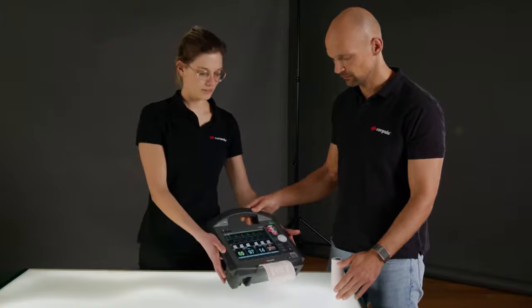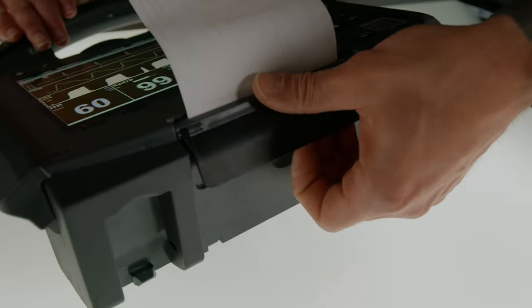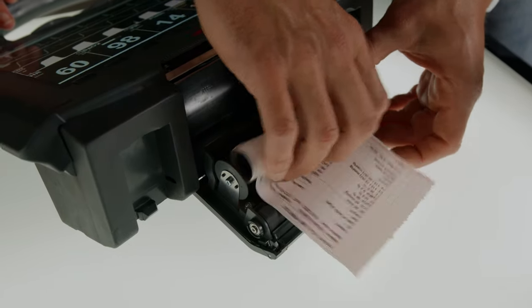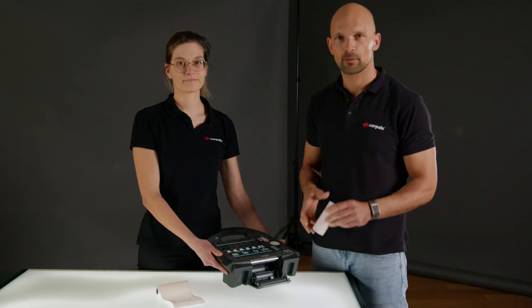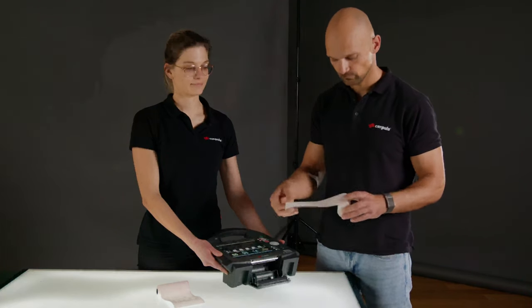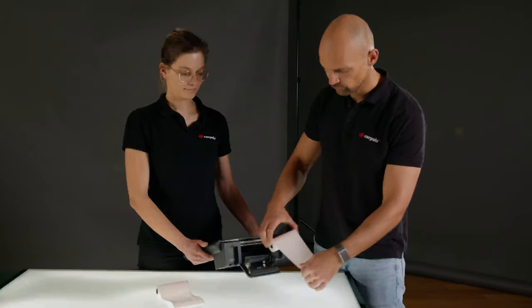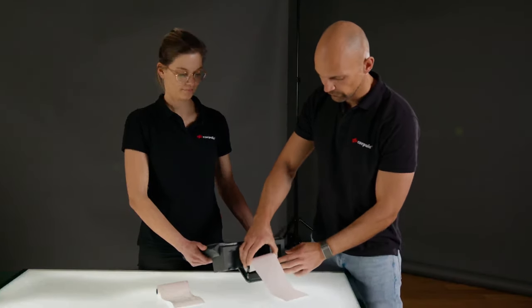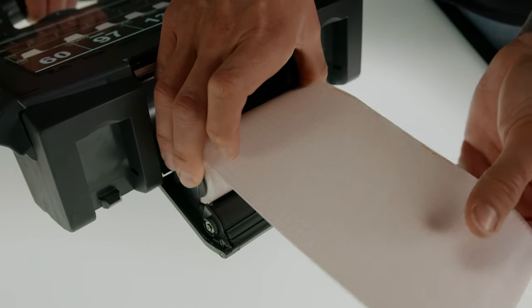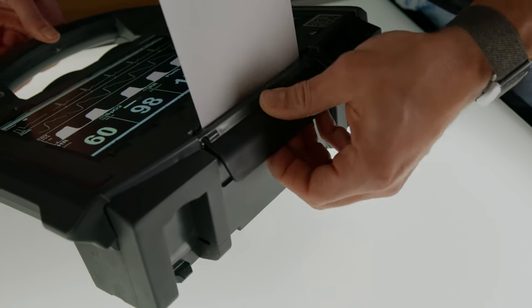To do so, just open the flap at the bottom of the monitor and remove the old printer paper in a forward motion. Take the new printer paper with the writing facing upward, unroll a little bit of it, and insert it from the front as straight as possible. Then we can close the flap again with the lever open.